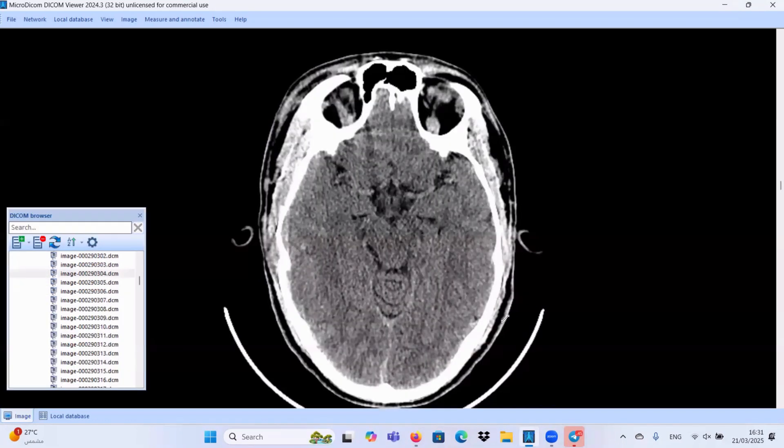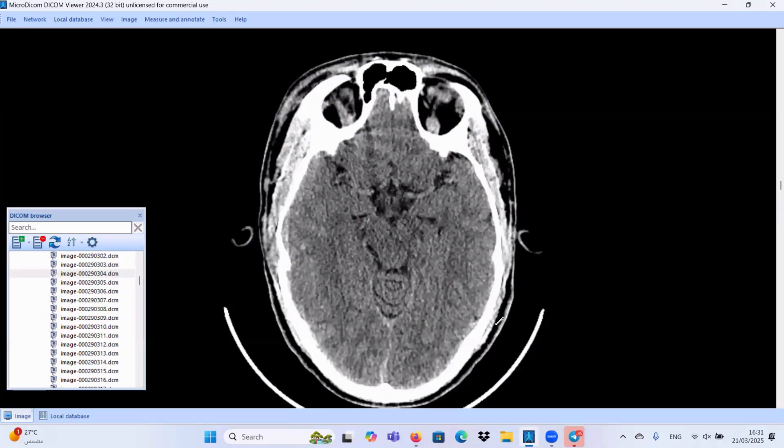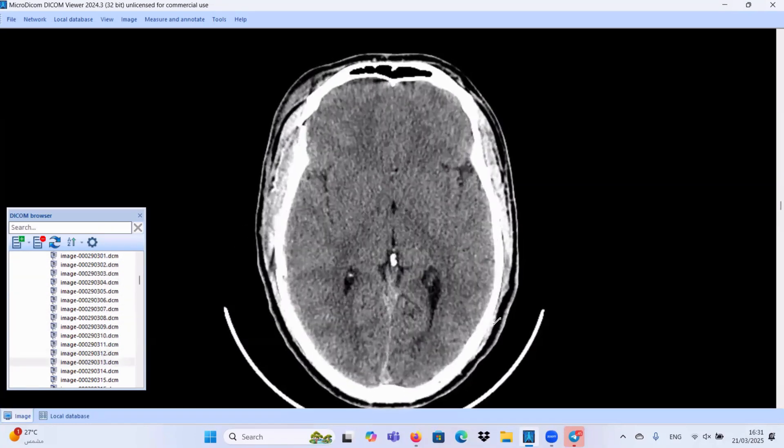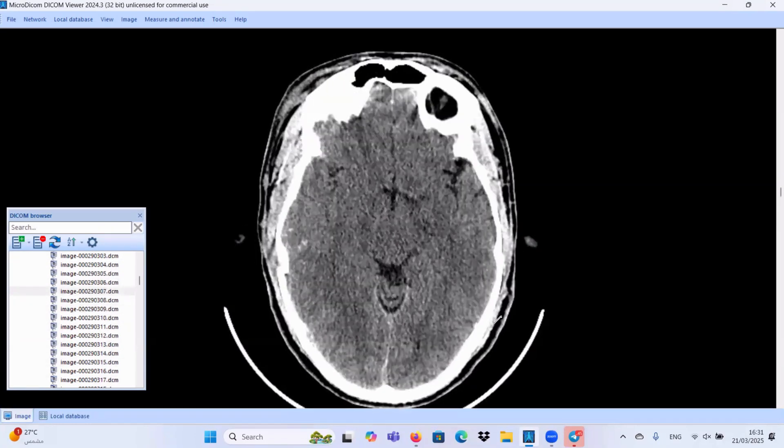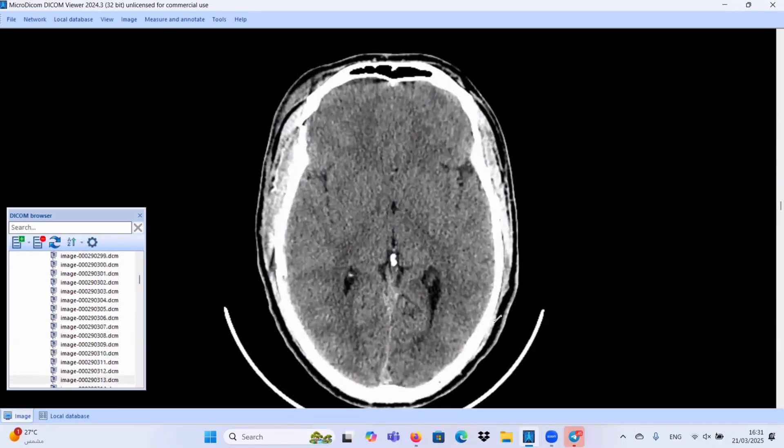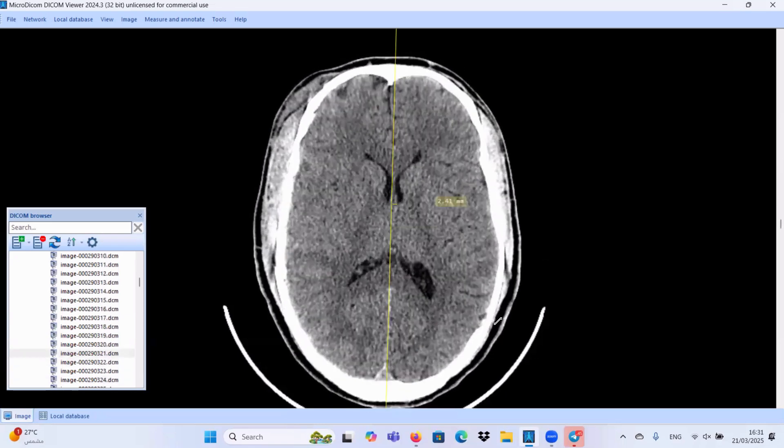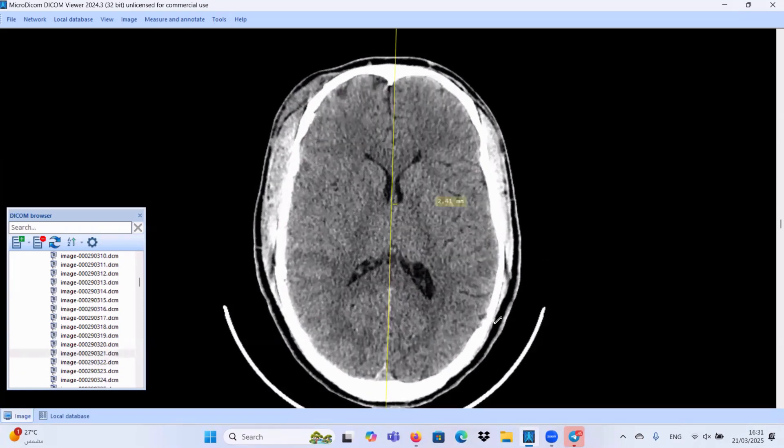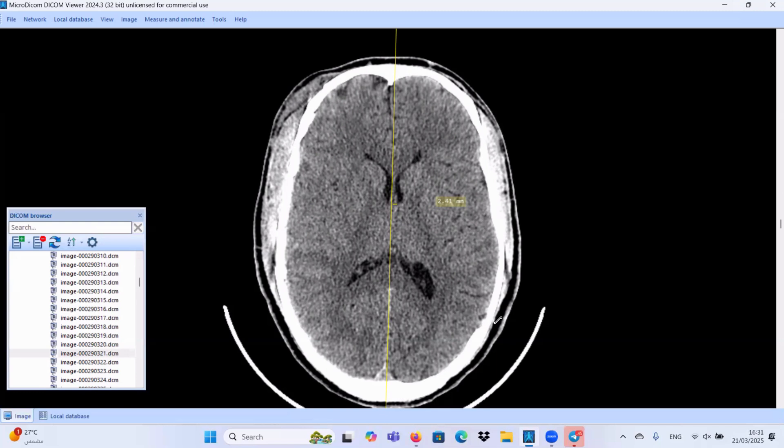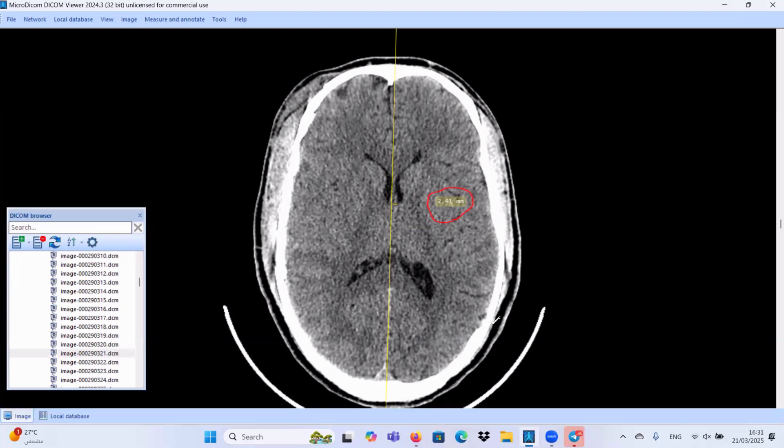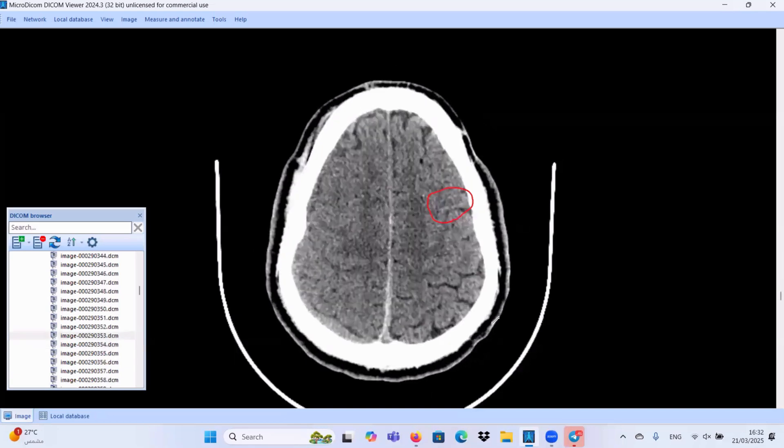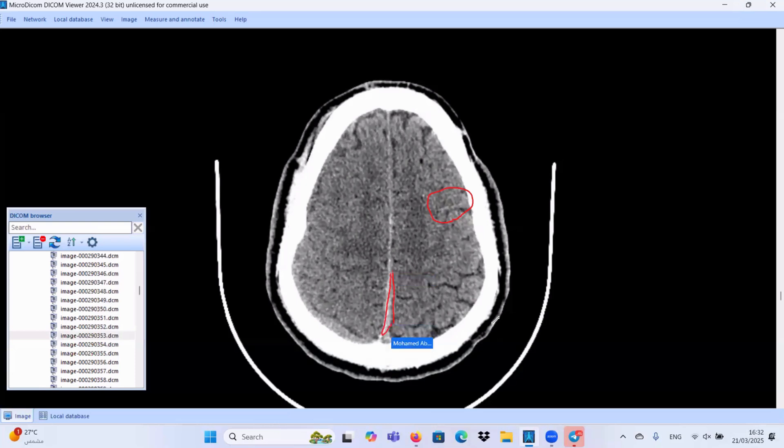Try to find any extra-axial collections. I think we have something like a subdural collection here, but really, I'm not sure is it present or not. Let's check in different planes. Once we have a suspicion of any extra-axial collections, we should measure any midline shift. The midline shift should be measured from the foramen of Monro as we did before in many cases. This is 2.4 millimeter midline shift which is minimal and not significant. We have here this falx cerebri. I think it is a little bit thickened posteriorly. Maybe subdural collection, I'm not sure.